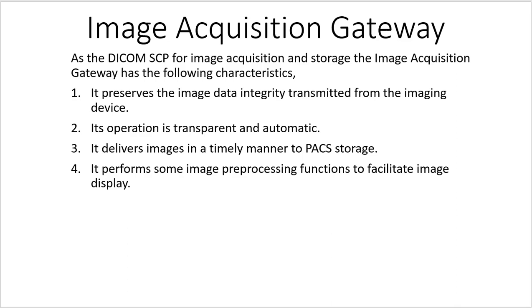So, 1. It preserves the image the way it came from the modality. 2. It doesn't require manual intervention from humans. It just does its thing. 3. It works as quickly as it possibly can. And 4. It will do some preprocessing functions to facilitate image display. And I'll explain that two slides from now.